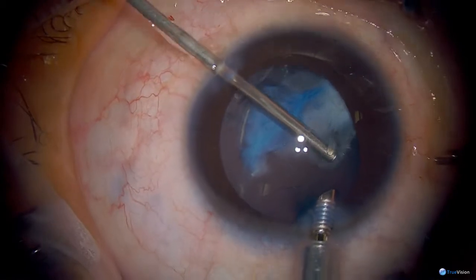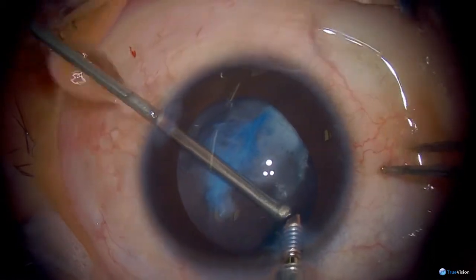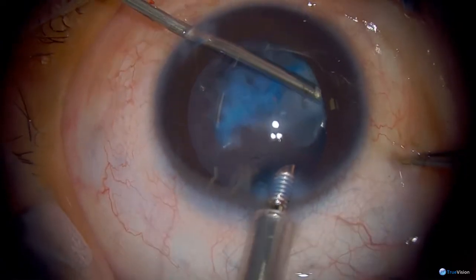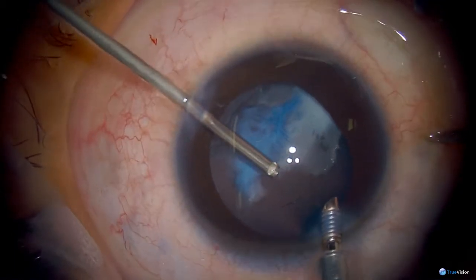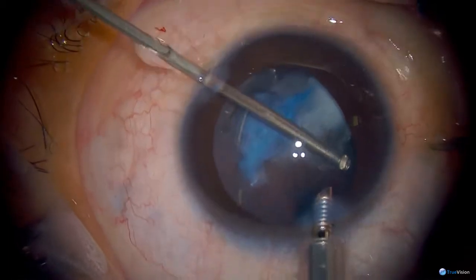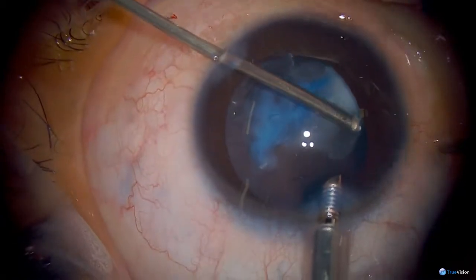We're just going to complete the removal of the rest of this material here. Most of it has been removed. All that's left is this fibrotic material. And I think we can open the lens now. So we're going to have to keep some of this fibrotic material. But I think we've removed enough.